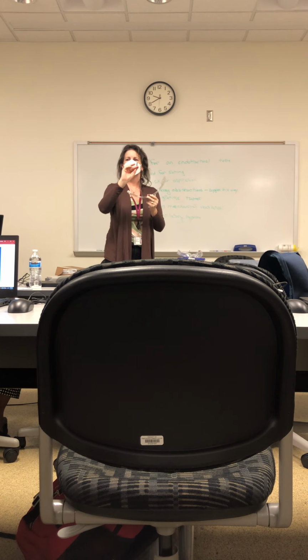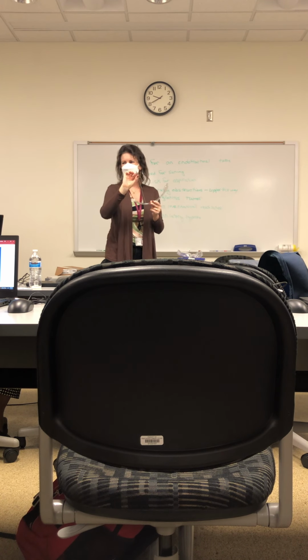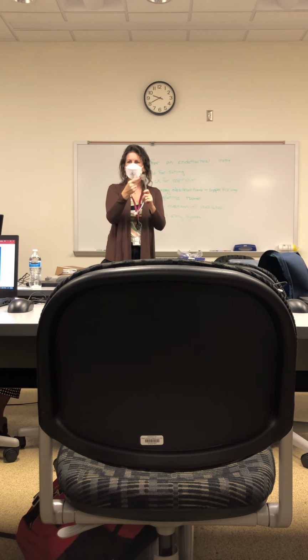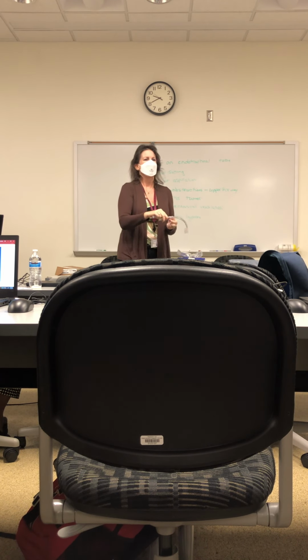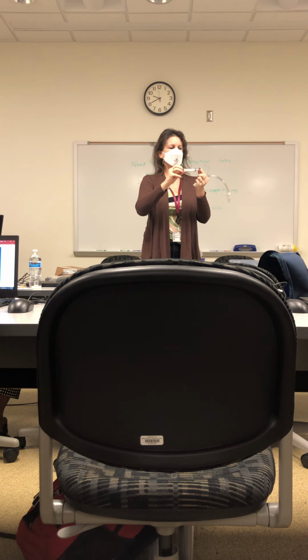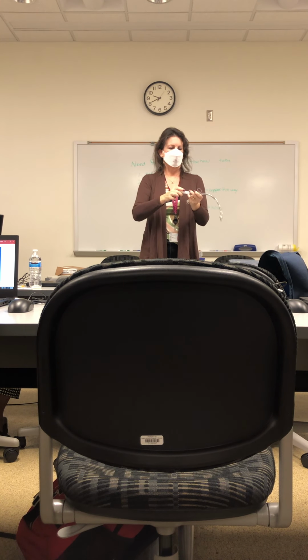What is this? Do you know what it's called? It's a pilot balloon. Okay, it's a pilot balloon. And there's a valve inside. There's a spring valve. Okay, so this is how we blow up our cuff. This is how we inflate our cuff. Okay, everybody, if your balloon is inflated, we always use a 10 cc syringe. And I want you to pull the air out of your cuff until it's deflated all the way. You're going to pull the air out.